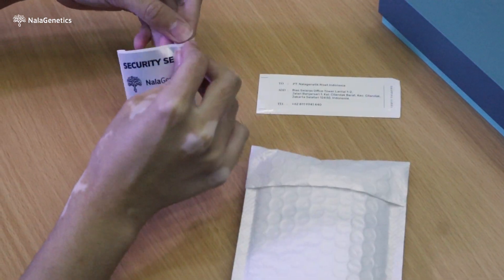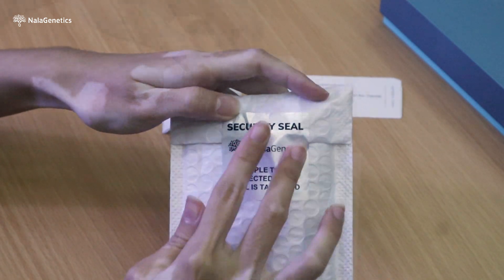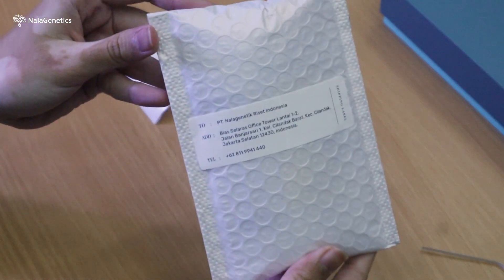Seal the polymailer and stick the security seal to make sure the package is not tampered. Next, stick the shipping label on the side of the polymailer and your sample is ready to be picked up!